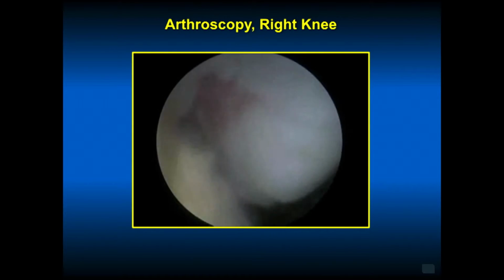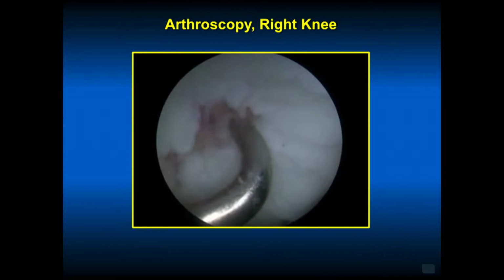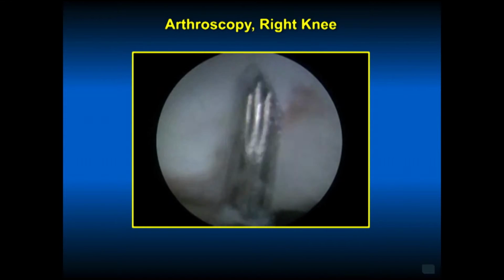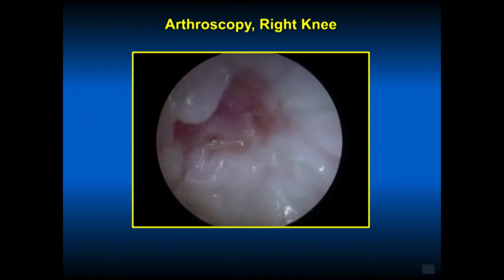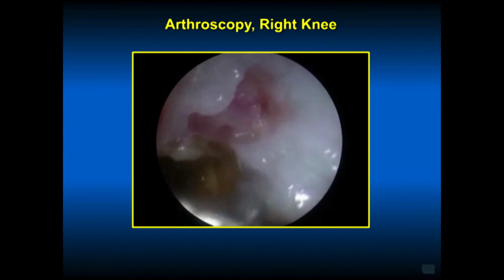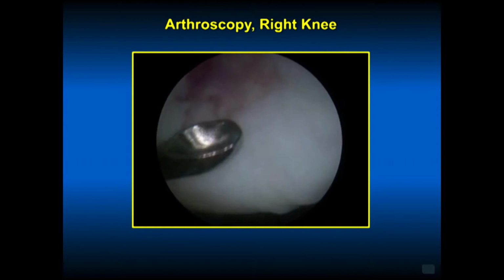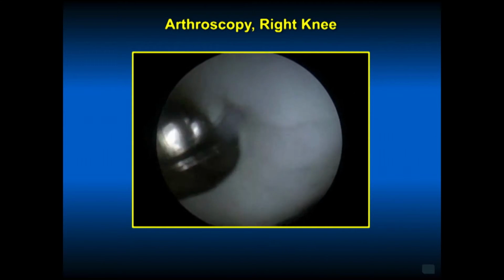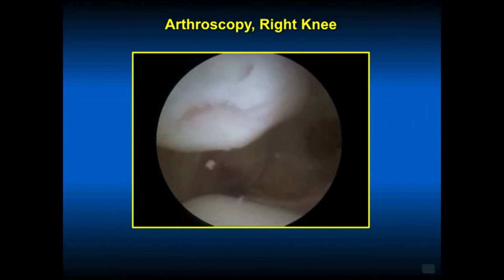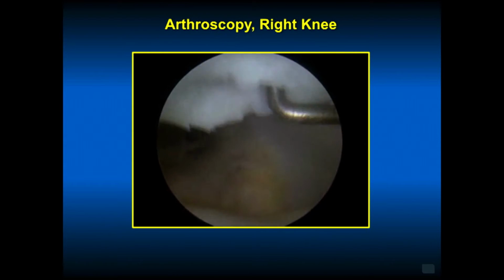And you can do, in an acute situation, a microfracture to get a better fill of fibrocartilage in the patella. It doesn't work quite as well as with a femoral condyle defect, but this was done, and there was good bleeding in this acute situation. Got the fluid off now, and use the shaver to see if bleeding occurs, if we've gotten it down far enough. And there were two small beds of where the original injury occurred and where the pieces came from.